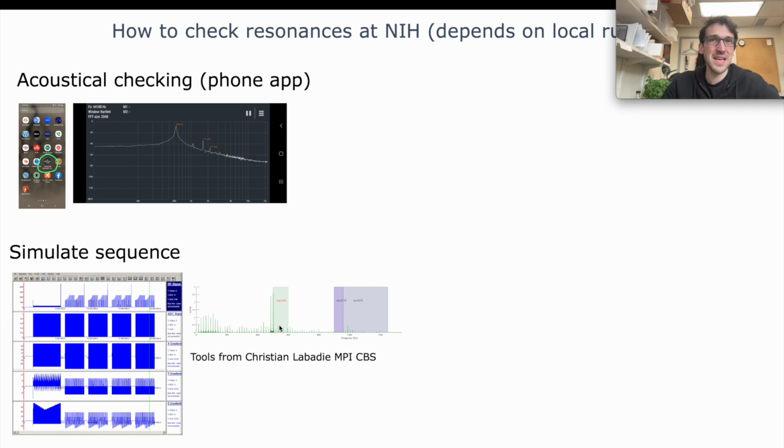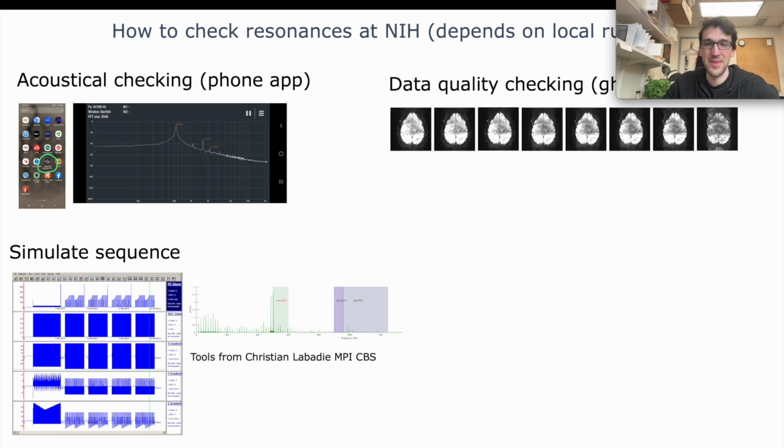So you always have sub-peaks or aliasing in the forbidden frequency bands, but how big they are allowed to be is kind of unclear. But this is helpful to optimize your protocol and allow you to shift the frequencies away.